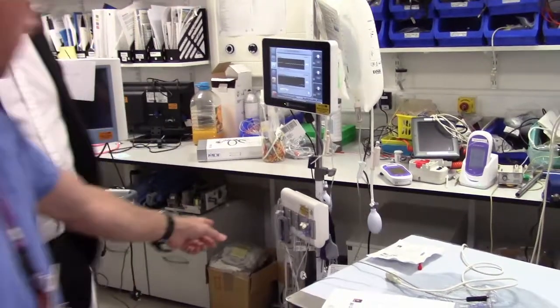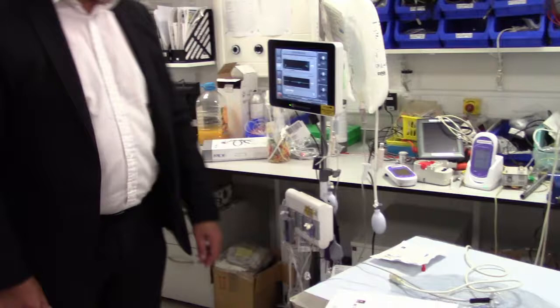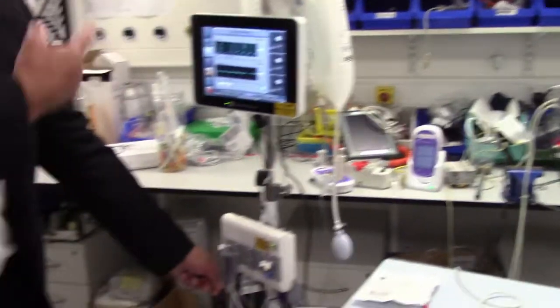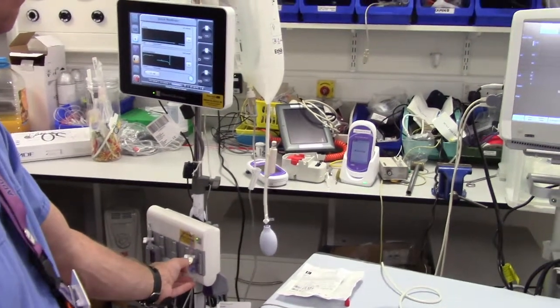You were fiddling with this earlier. What's that do? That's the flush. No, I was just doing a square wave test. All I was doing was checking that I was getting a signal back to the monitor just by flicking the transducer. Okay, so you can do the same with this one? You could do, yeah. Exactly, just flick it. You get exactly the same thing going on.